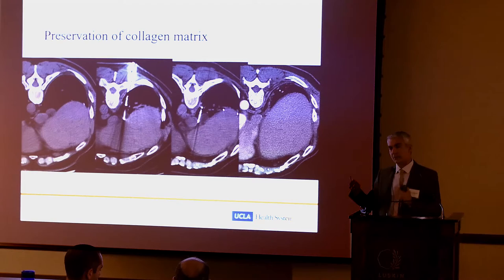This is an example of a patient. These were the two tumors we wanted to ablate. As you can see, there's tumors here, the tumors here, and the tumors here, and we went back and got them all. But this was the interesting part. We don't want the ice ball to grow into the cord and the canal, and we can't do that. But for these simple two nodules, we had to place 4 probes, and got a sort of large ice ball in that region.